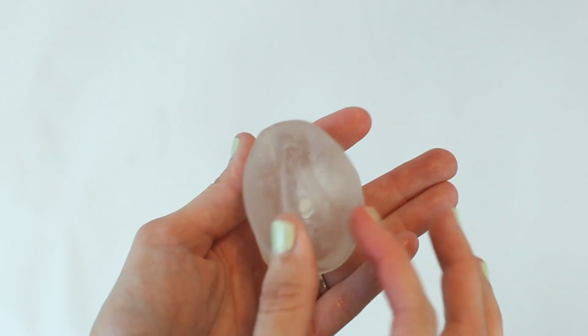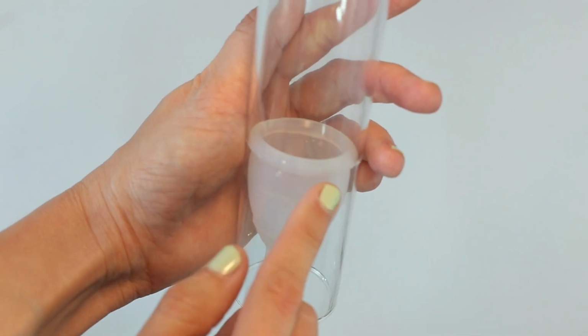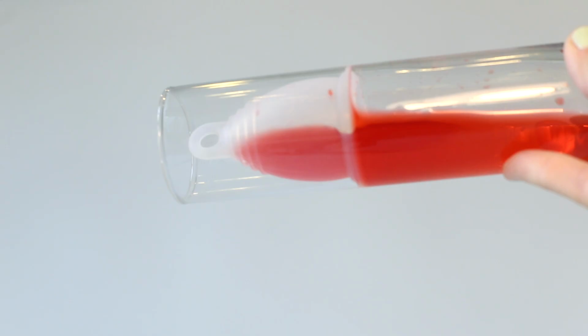Once your cup is high enough and at that correct position where everything feels good to you, you can also just hold the base and give it a small spin, and that will help make sure it's open and sealed. You can also take your finger and work your way around the cup while inside to make sure there are no creases or folds. This will make sure that you have a leak-free experience.